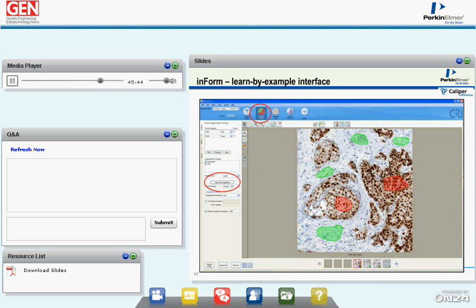And now in this image, you can see how there is now a red and green mask on top of the image. The red is showing where the tumor is, and the green is showing where the stroma is. And then the software has cellular segmentation algorithms that can go into any of the tissue areas and segment individual cells.